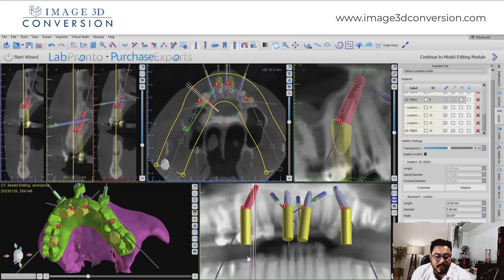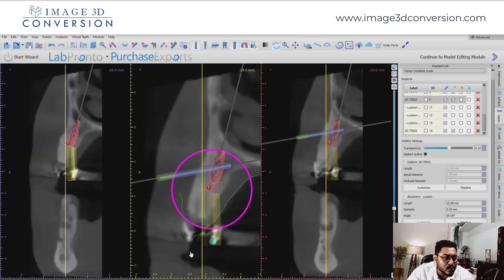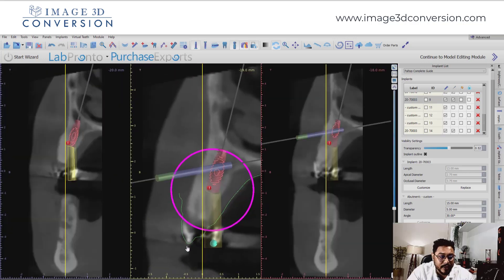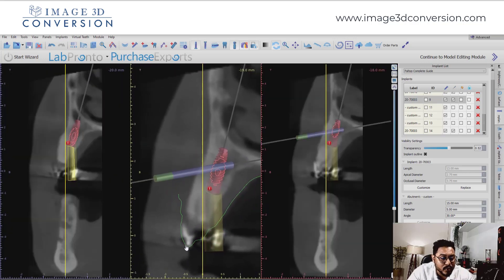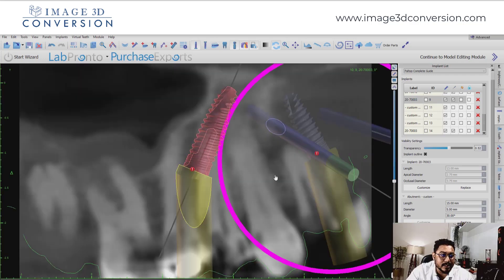Pan view is used for mesial-distal angulation — to verify the implant site and to keep the implants at the correct mesio-distal angulation. Then in the sagittal window, we give buccal-lingual positions of the implant, or move the implant in buccal-lingual positions. Don't scroll your mouse in this window.